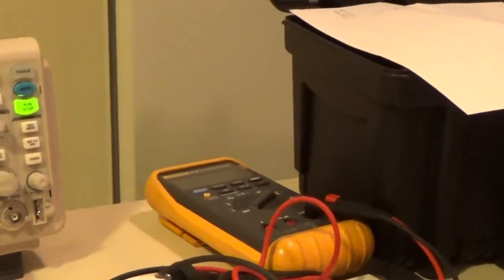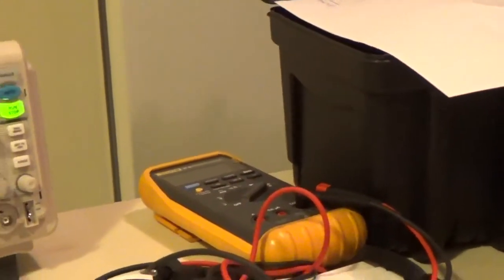And we don't know how many volts is how many kV. Does it say? Let's look. Right here, they're saying, if you look here, 80 kV equals 8 volts. So 1 volt equals 10 kV. Doesn't matter if it's on a dynalyzer or a scope, that would be the same. So we're basically just going to look. But it's the same millisecond as the other one. Volts per division.